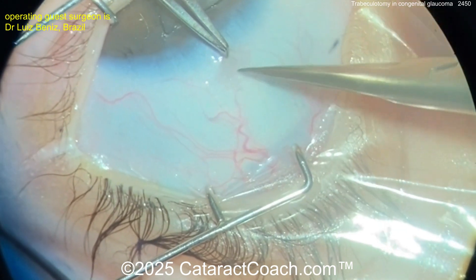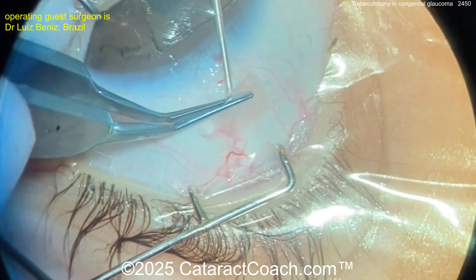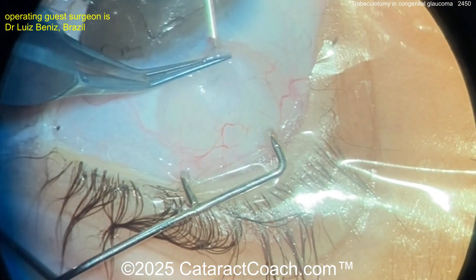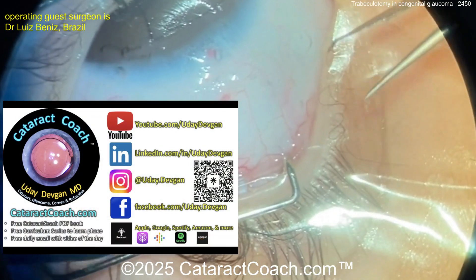Tractions are being placed here. A little conjunctival peritomy being performed here with Westcott scissors and some forceps, and now injection of probably some lidocaine with epinephrine for some hemostasis.